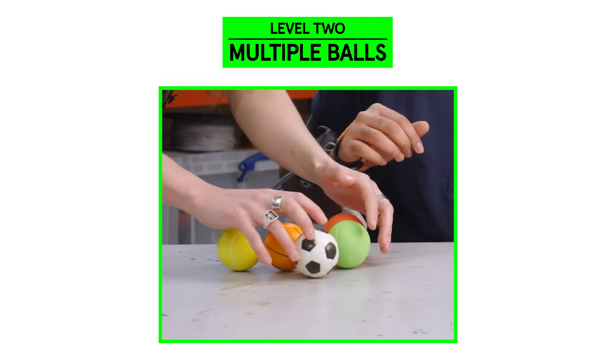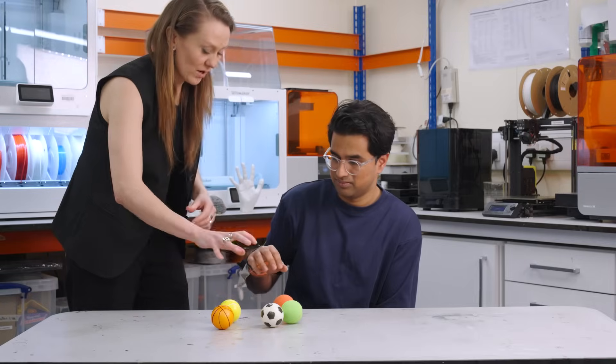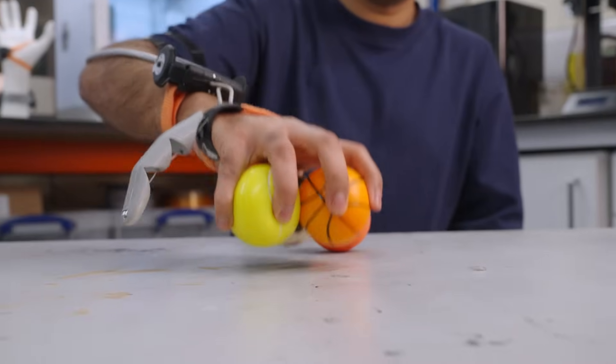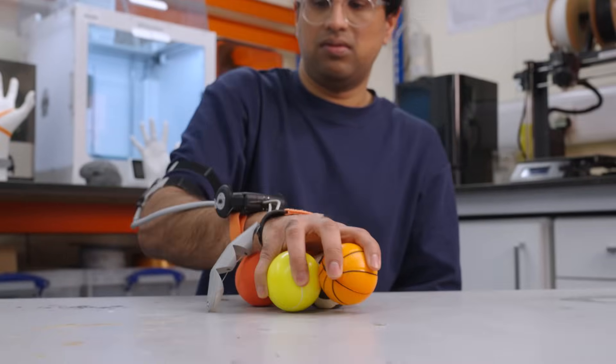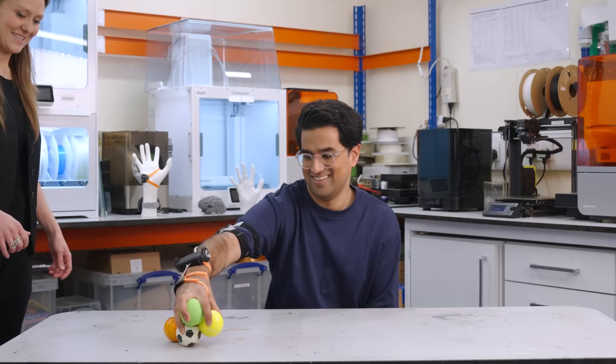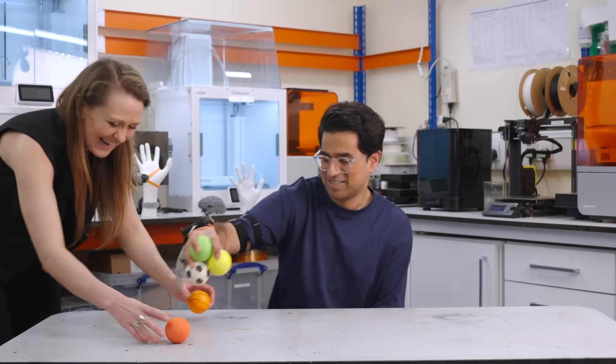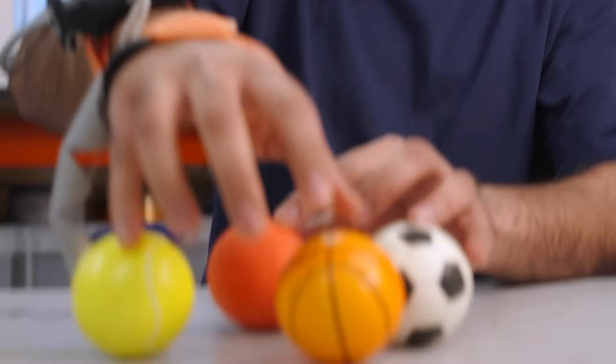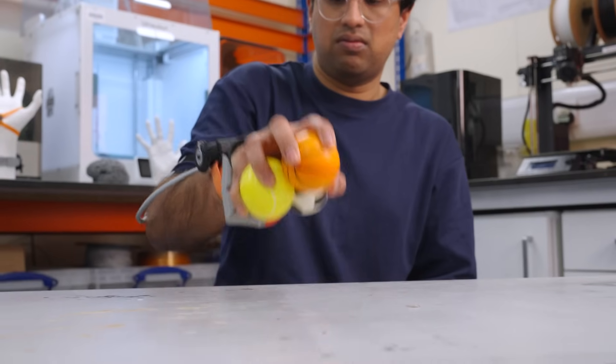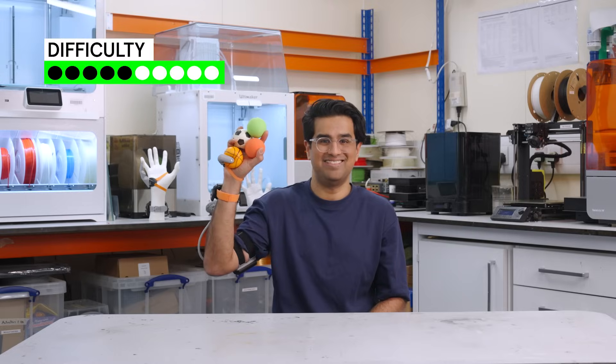This is our next object task. Pick up as many balls as you can with your biological hand and then use the third thumb to pick up the last ball or an extra one. The goal of this test is to determine what the third thumb can do to expand the function of the hand overall. Difficulty, six out of ten.